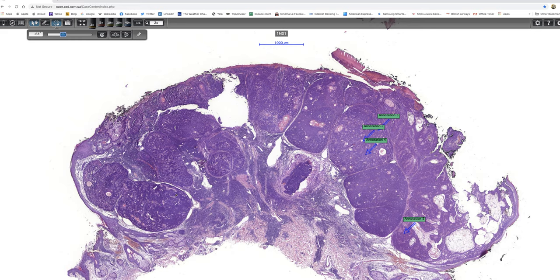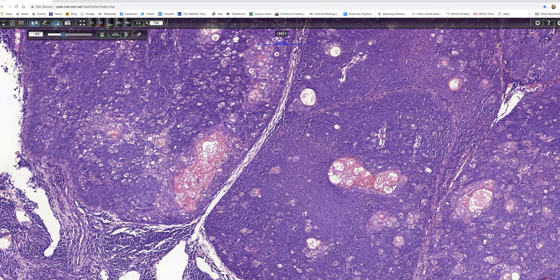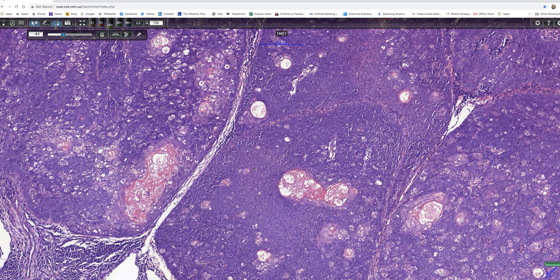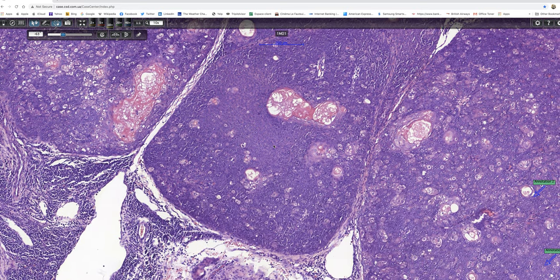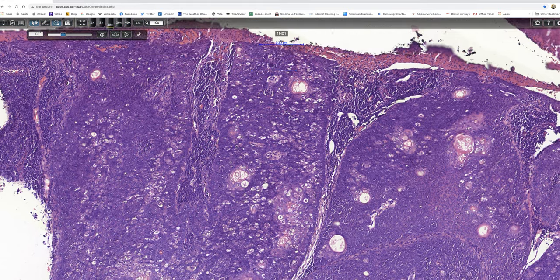When I look at the low power of this second piece, it's multinodular, which gives us a differential diagnosis of possibly sebaceoma or alternatively sebaceous carcinoma. I wanted to draw your attention to the keratin-lined ducts. Sebaceous tumours of varying sorts typically show differentiation of all parts of the follicular sebaceous unit, and these structures represent abortive differentiation towards the duct. They may be seen in any sebaceous tumour, but they are particularly numerous in sebaceoma.